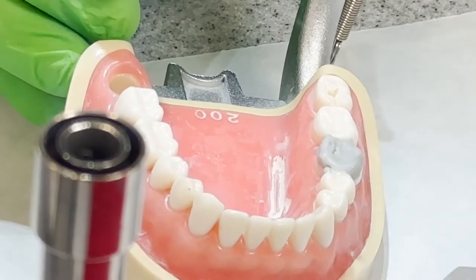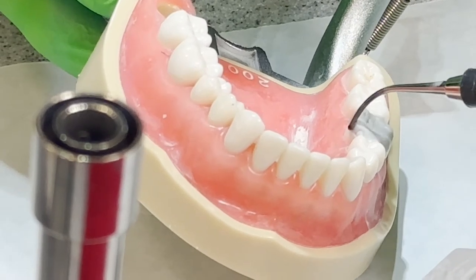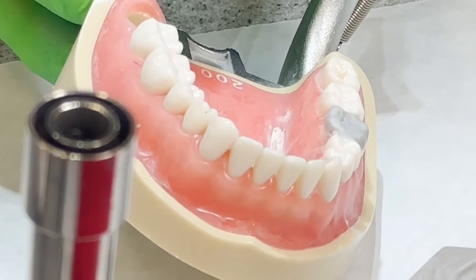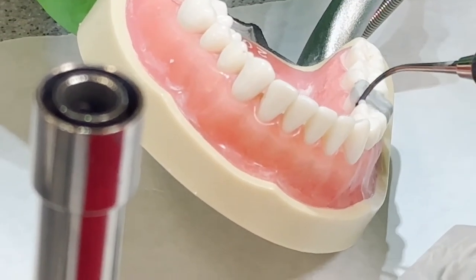Remember, this tooth has a lingual incline, so you want to make sure that you incorporate that with your waxing here, okay? You don't want those lingual cusps too far on the buccal.